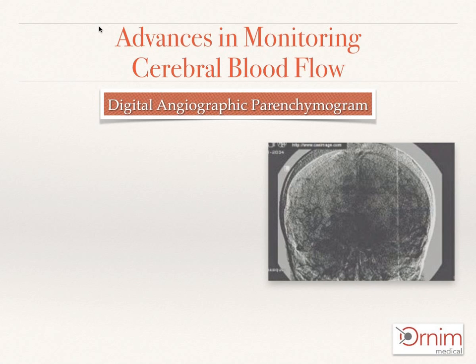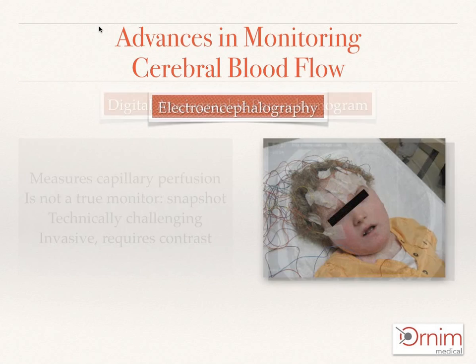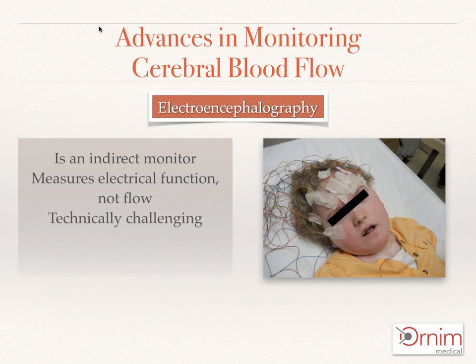Digital angiographic parenchymography is another way of looking at the microvasculature. It measures capillary perfusion simply by giving us a qualitative snapshot of the brain. It is also technically challenging and also is invasive, requiring contrast. Electroencephalography is a monitor. It measures electrical function, however, not flow. So it's using electrical function as a surrogate for flow, and it too is technically challenging.